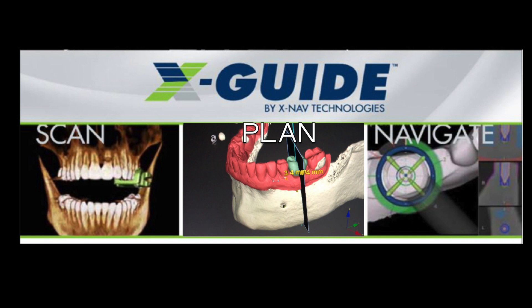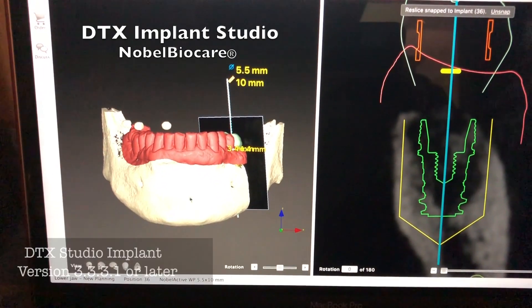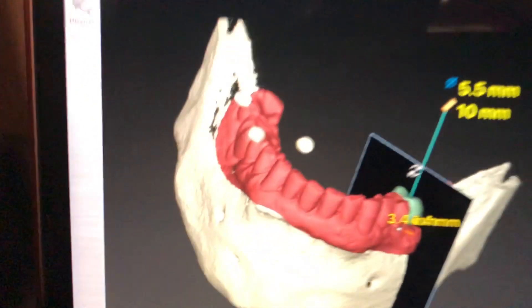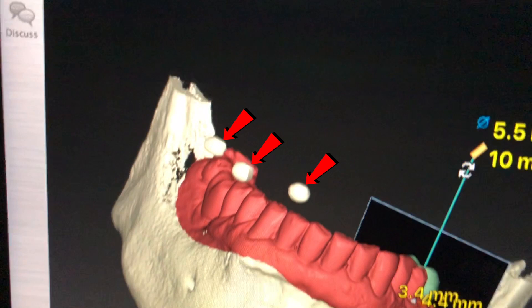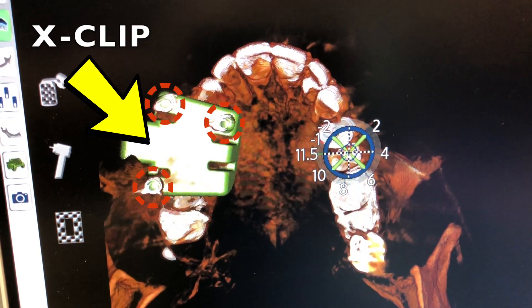Once we have that CBCT scan, we're going to prepare the scan using DTX software, and then we're going to take that software plan and transfer it into the X-Guide where we'll do the navigation. Once we take this DICOM file, we can move it into the DTX software and we'll notice that the fiduciary markers are present — there are three shown on the red arrows. It's important to have that X-Clip in position when taking the DICOM scan, because this is what we're going to use to line things up to the handpiece and to the implant itself. Here is showing what the fiduciary markers look like on the X-Clip.